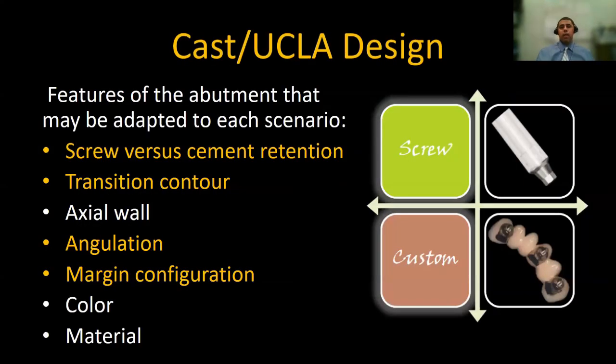Now, in dentistry, when you start talking about custom abutments, remember that traditionally those will be fabricated by UCLA type abutment. So they are cast to abutment. So it provides a platform for the lab technician to build the abutment around. And nowadays, if you still need to manufacture a traditional screw retained restoration, that's probably still the way to go.